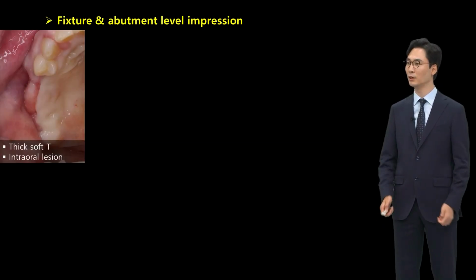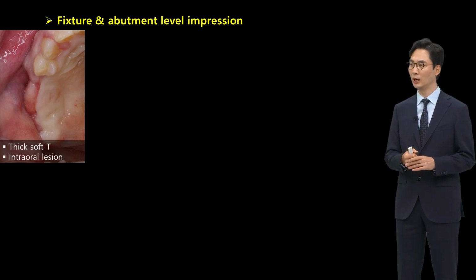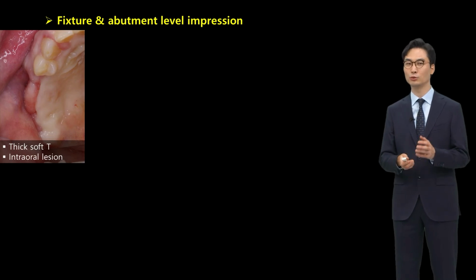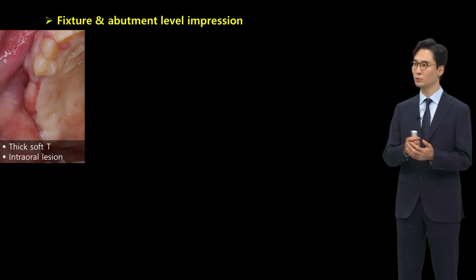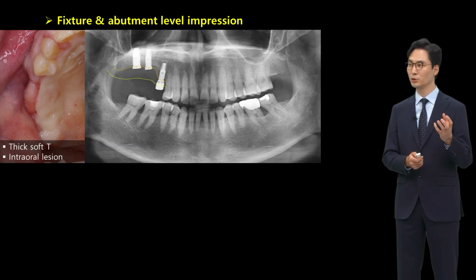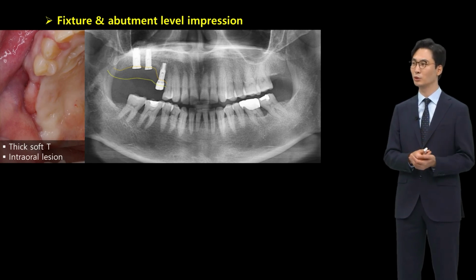Let me share with you a clinical case. The patient came to my dental clinic after having had oral surgery due to an intraoral lesion in the upper right number 5, 6, and 7. After surgery, a bone defect was formed and there was a lot of scar on the soft tissue, and the condition was not very good. It was very thick.